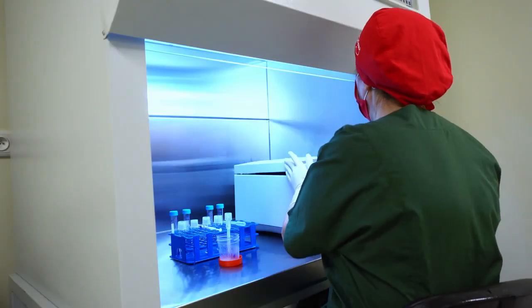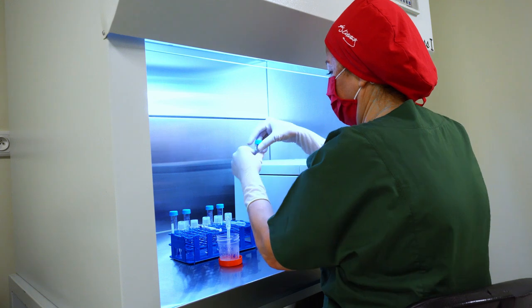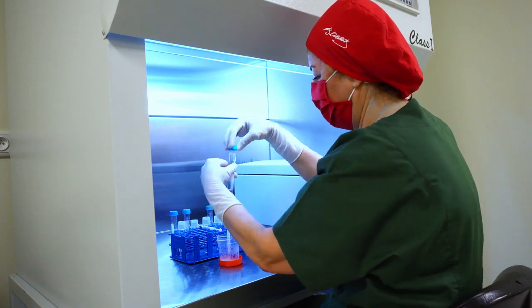Conventional IVF procedure, a step-by-step guide. Semen quality is the key point while deciding to do CIVF or ICSI.